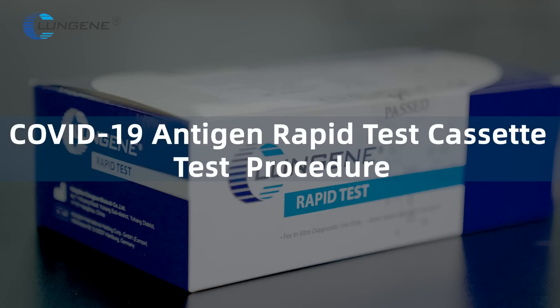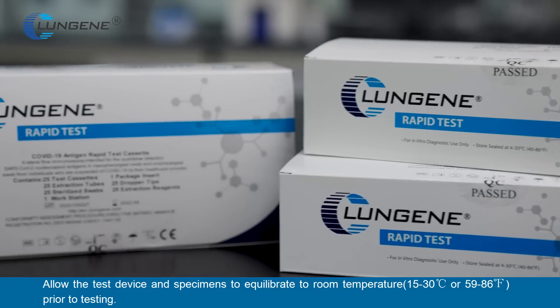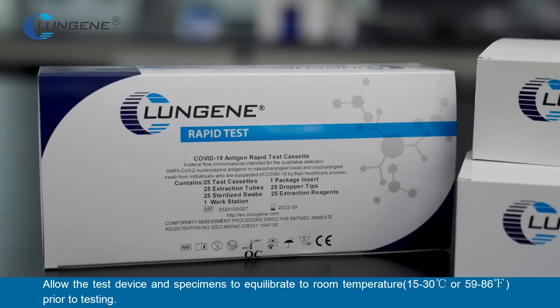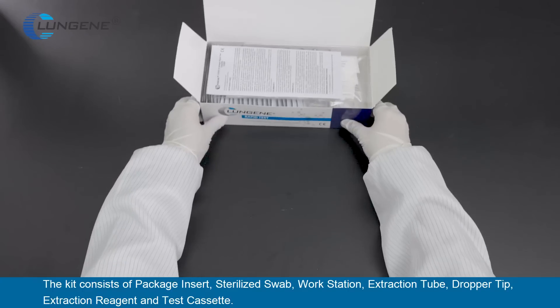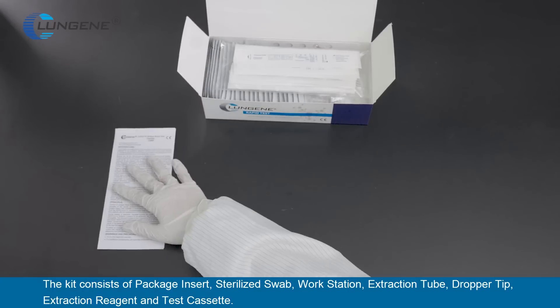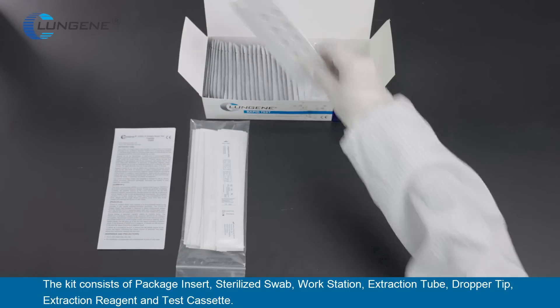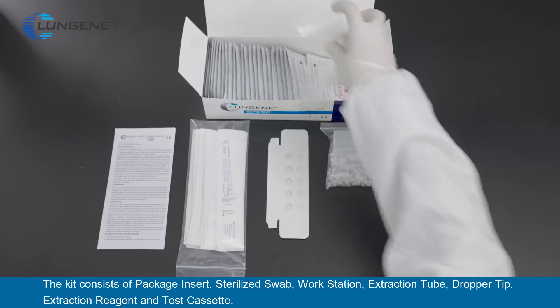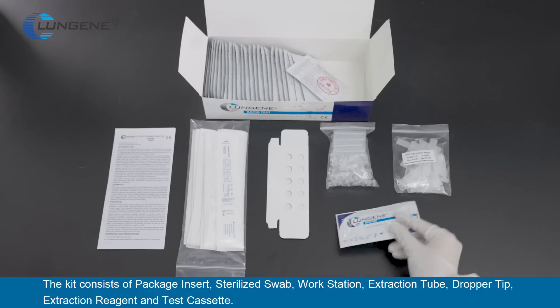COVID-19 Antigen Rapid Test Cassette Test Procedure. Allow the test devices, reagents, and specimens to equilibrate to room temperature prior to testing. The kit consists of a package insert, sterilized swab, workstation, extraction tube, dropper tip, extraction reagent, and test cassette.